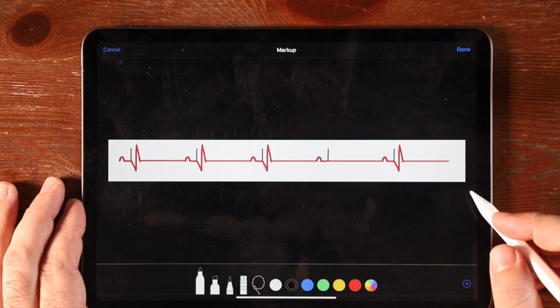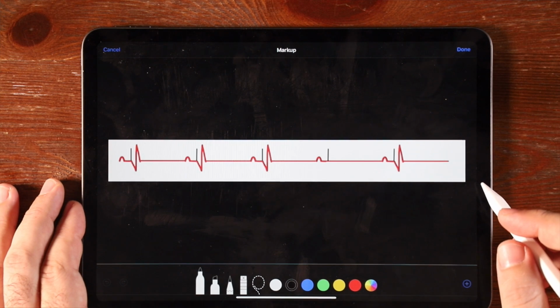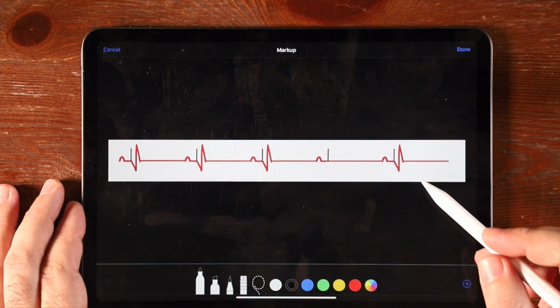So what are some of the pacemaker failures? We have 3 of them, and we're gonna talk about all 3 of them. And at the end, I'm gonna give you a test so that you can solve on your own. So this is the first failure.